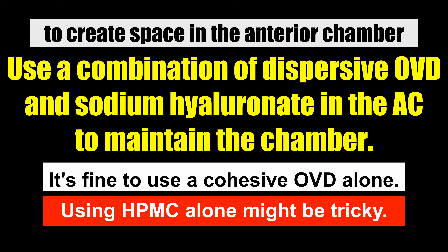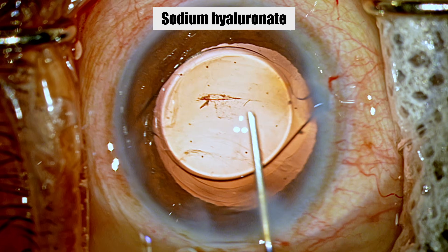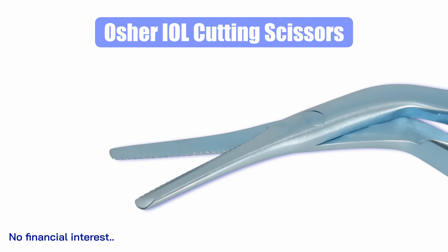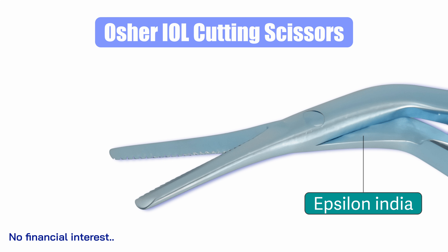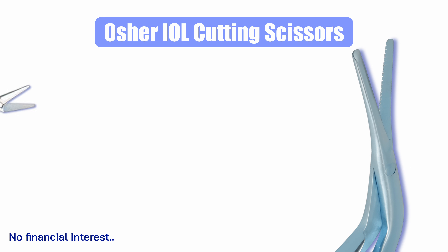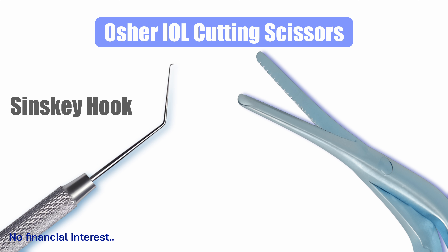Using HPMC alone might be tricky because when maneuvering the scissors inside the eye, there's always a risk of the chamber becoming shallow, which can lead to collateral damage. In this case I'm using sodium hyaluronate. The instrument I'm using to cut is a toothed scissors — the Osher lens cutting scissors, which I sourced from Epsilon India. There is another pair of scissors with forceps made by MST, but they're expensive, so I prefer to manage with this scissors and a Sinskey hook.